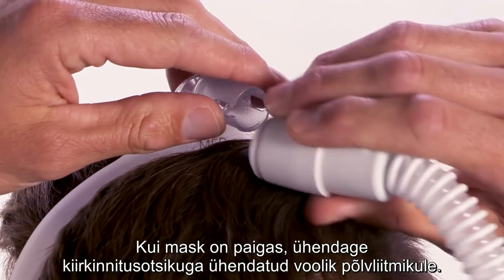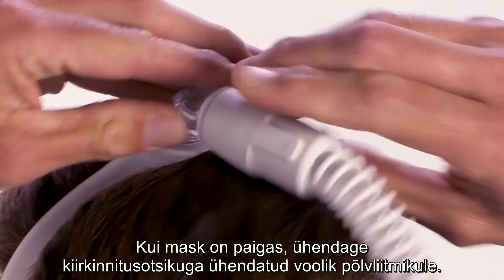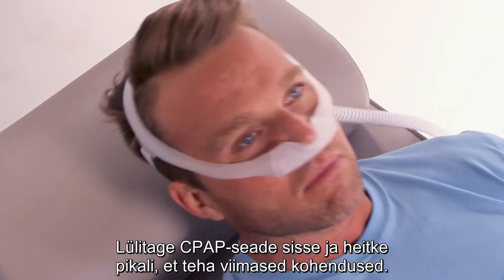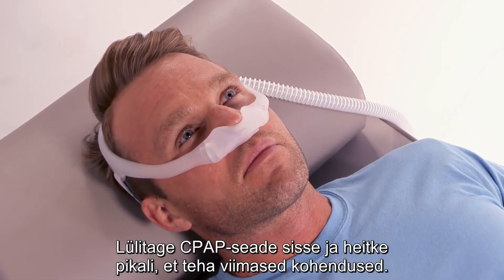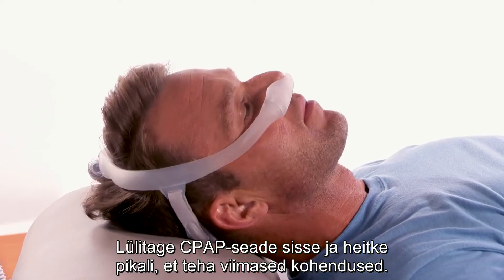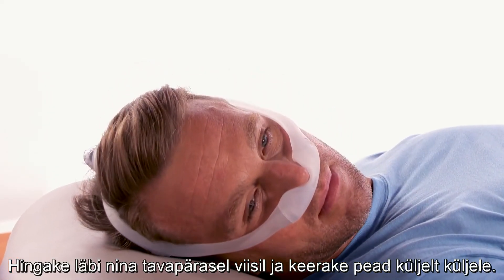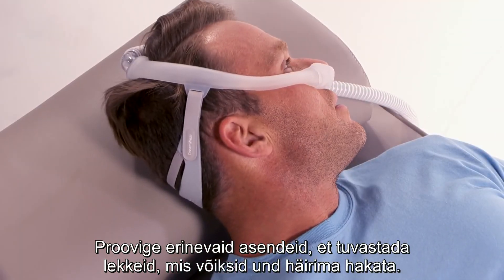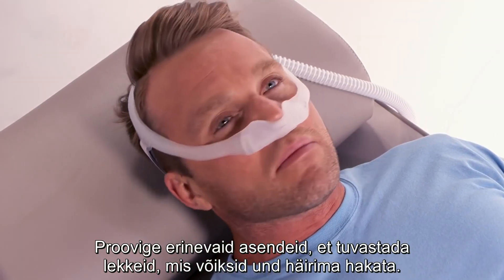Once the mask is in position, connect the quick release with the attached tubing to the elbow. Turn the CPAP device on and lie down for final adjustments. Breathe normally through your nose and turn your head from side to side. Assume different positions in order to identify any leaks that may interfere with sleep.